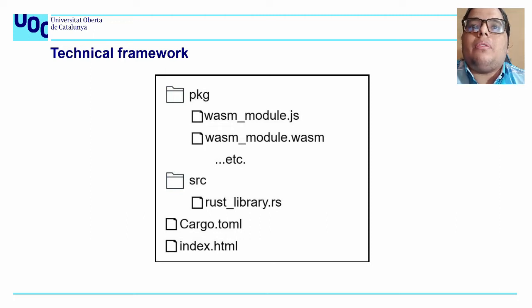This project consists of a front-end application without any backend services. The main module of the application is a Rust library that encapsulates the crate DICOM-rs and can perform DICOM manipulation. This library then is compiled to WebAssembly and loaded from the front application.